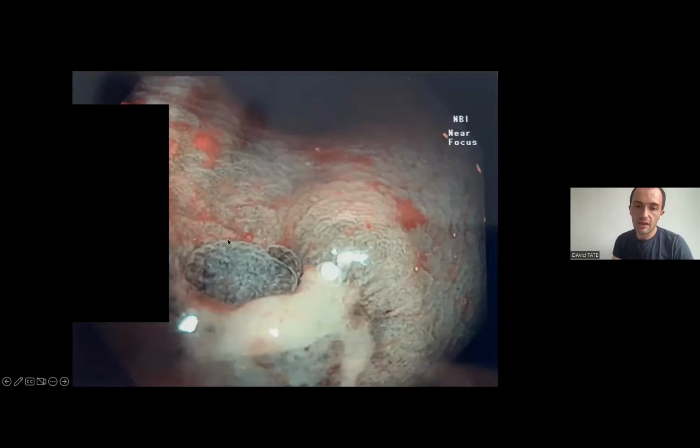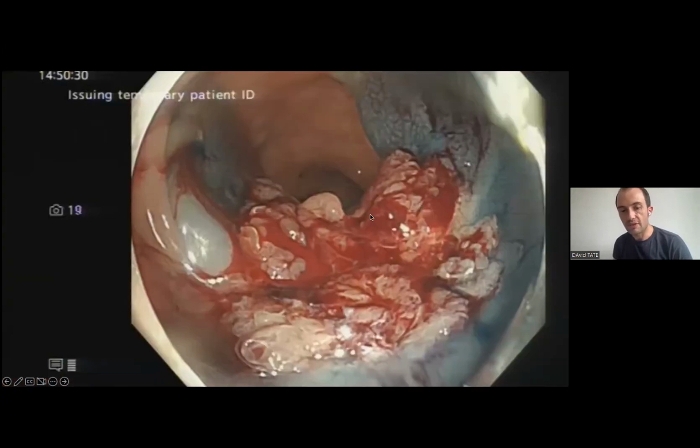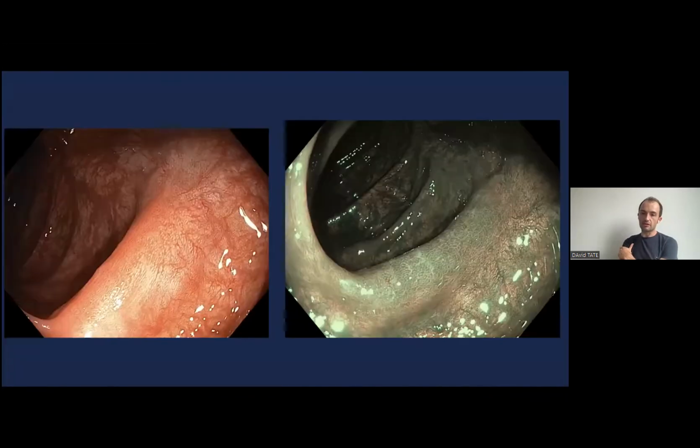Here you see a polyp remaining a few days after a polypectomy, and you can clearly see the polypectomy site is not clear. Here you can see a large recurrence within a scar. Here you can see a very bad attempt at polypectomy, which probably means the patient has to go for surgery immediately rather than later on, because the person doing the polypectomy has not been able to complete it. And here you can see the opposite end of the spectrum with a nice, beautiful scar when polypectomy has been done properly.